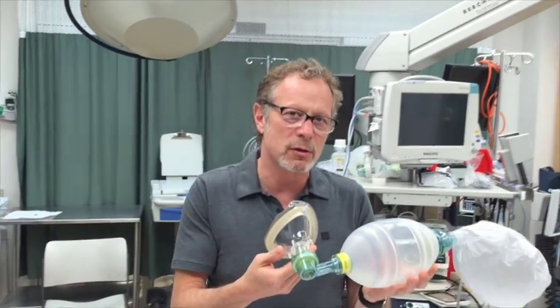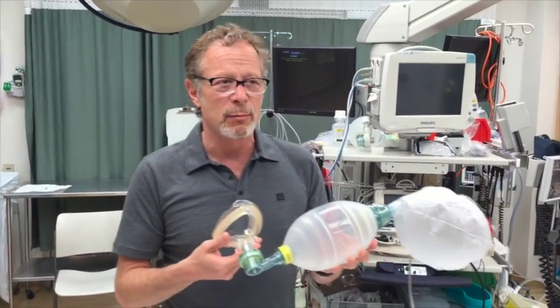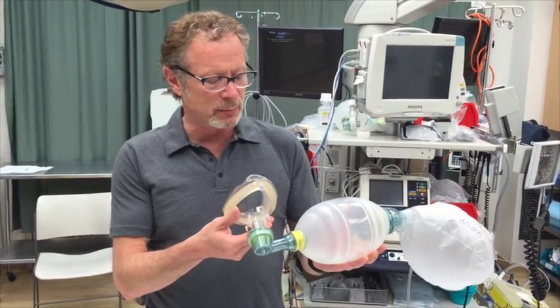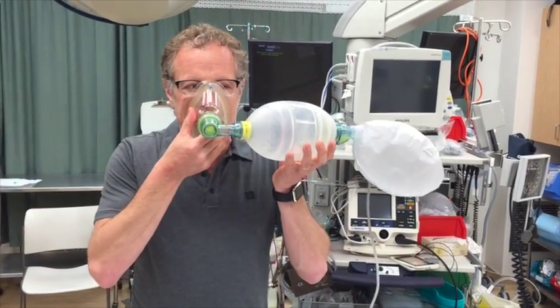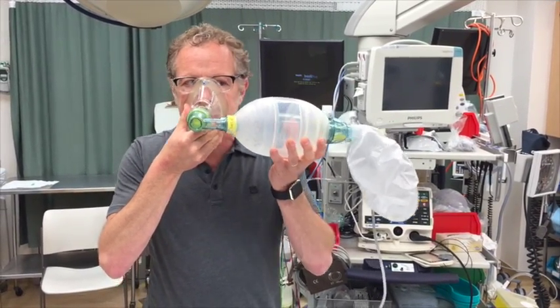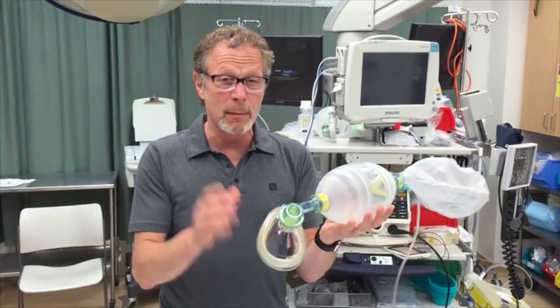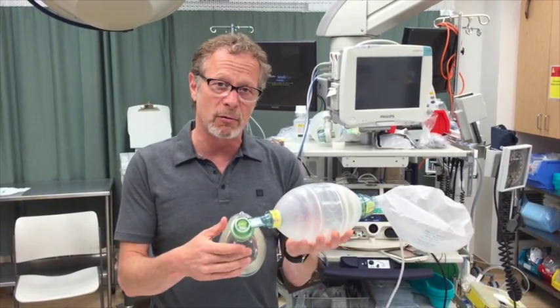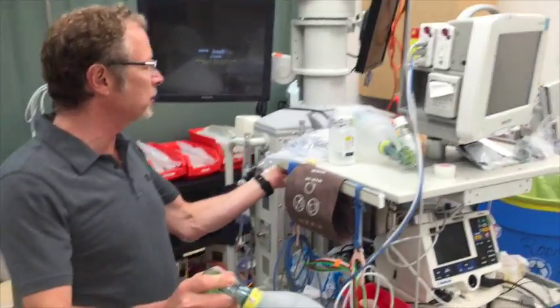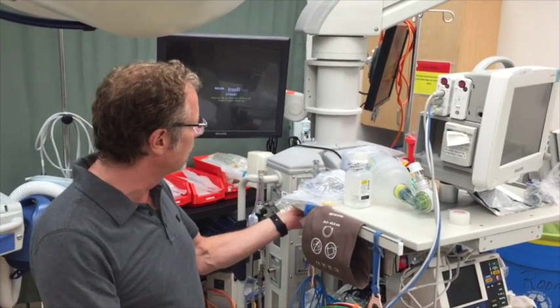So I'm getting close to 95% oxygen this way. But now assuming I'm sick, I'm going to increase my respiratory rate and my tidal volumes are going to creep up toward vital capacity breaths. It doesn't take much for that bag to collapse — my minute ventilation is exceeding the flow coming into the system.